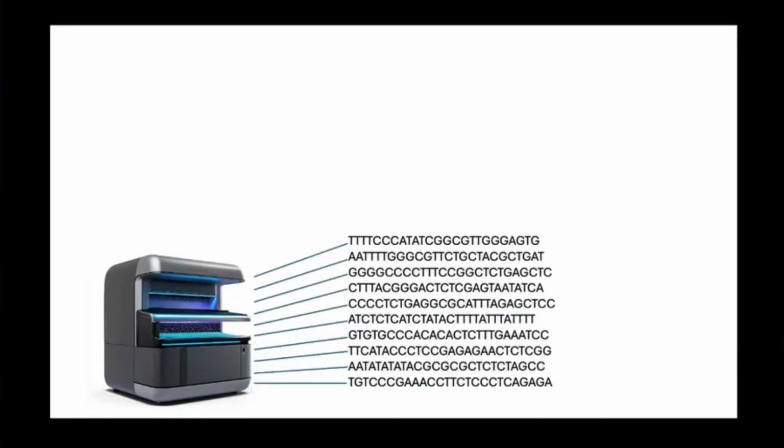To recap quickly, we ended the last lecture with the sequencing itself. The sequencer just takes in a large number of molecules, and it gives us sequences of a representative subset of those molecules. We can tailor it to get as many reads as we want for a particular assay, for a particular patient, by carefully selecting which flow cell we use and proportionally loading the samples in order to get the number of reads we want.